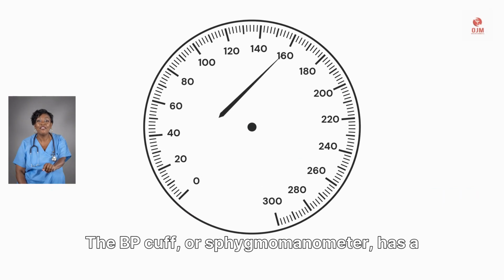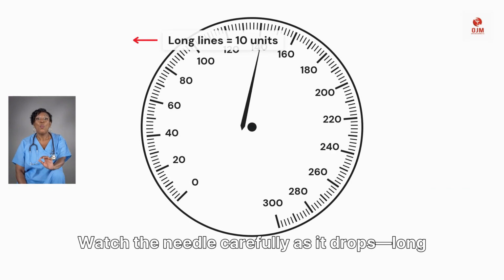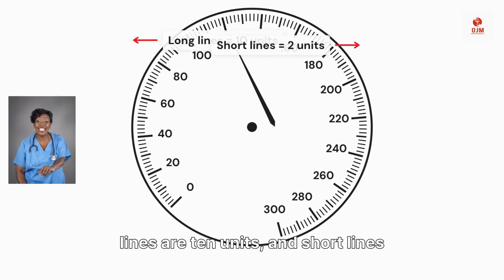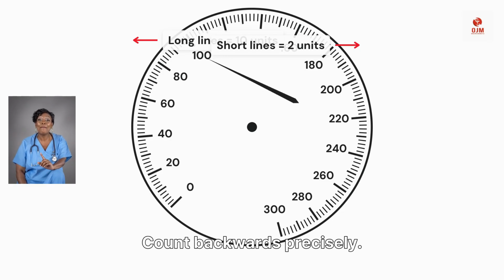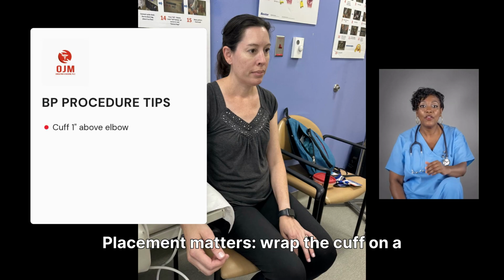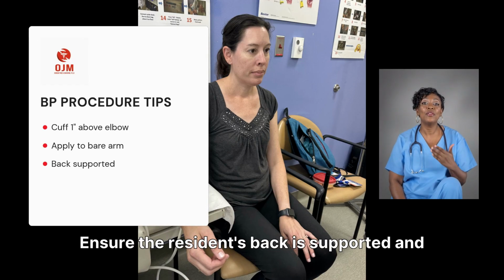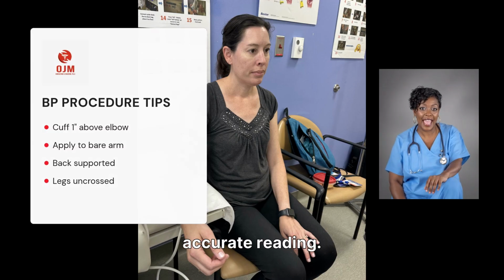The BP cuff, or sphygmomanometer, has a manometer gauge. Watch the needle carefully as it drops. Long lines are 10 units and short lines represent 2. Count backwards precisely. Placement matters. Wrap the cuff on a bare arm 1 inch above the elbow. Ensure the resident's back is supported and their legs are not crossed for an accurate reading.